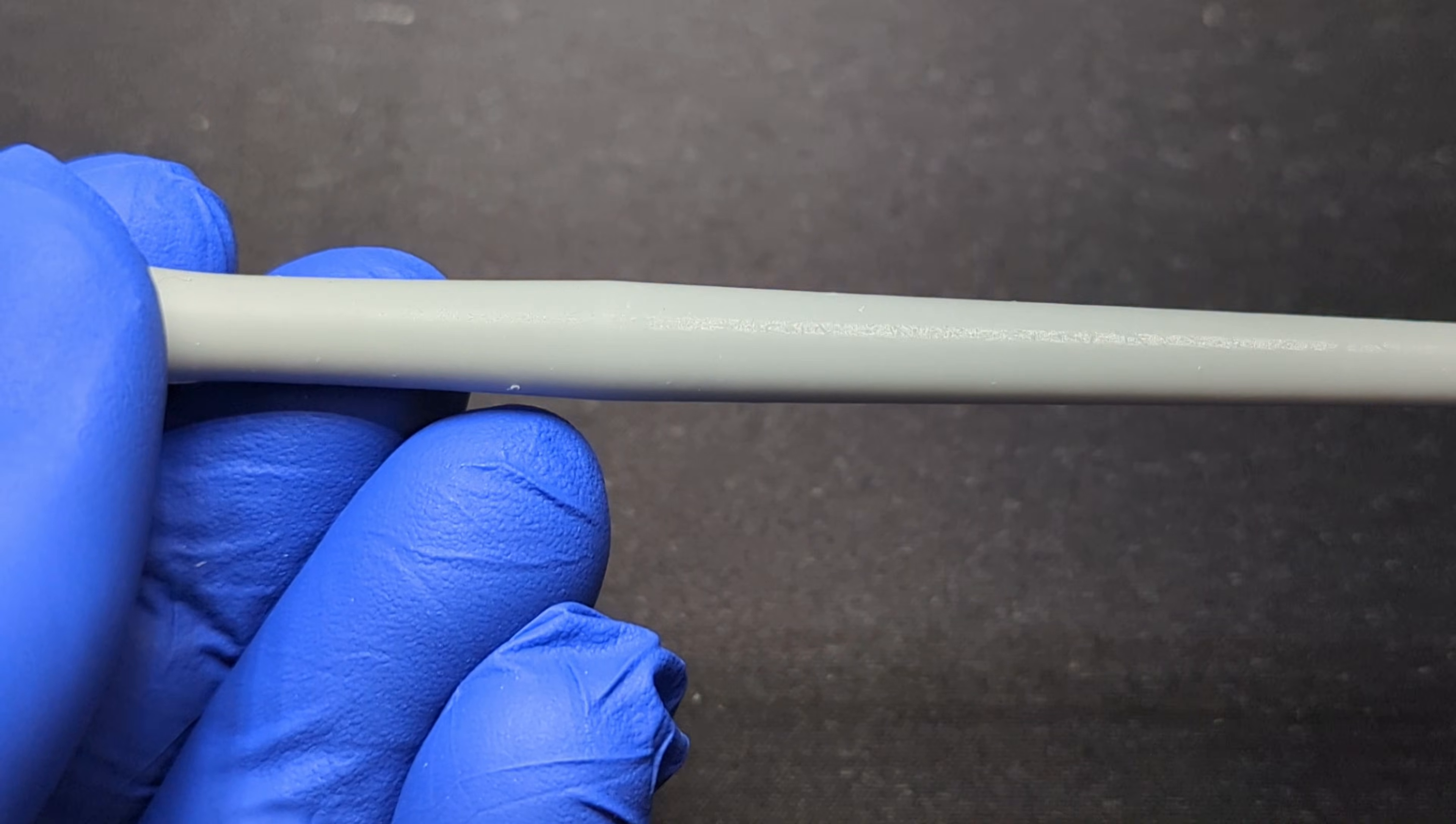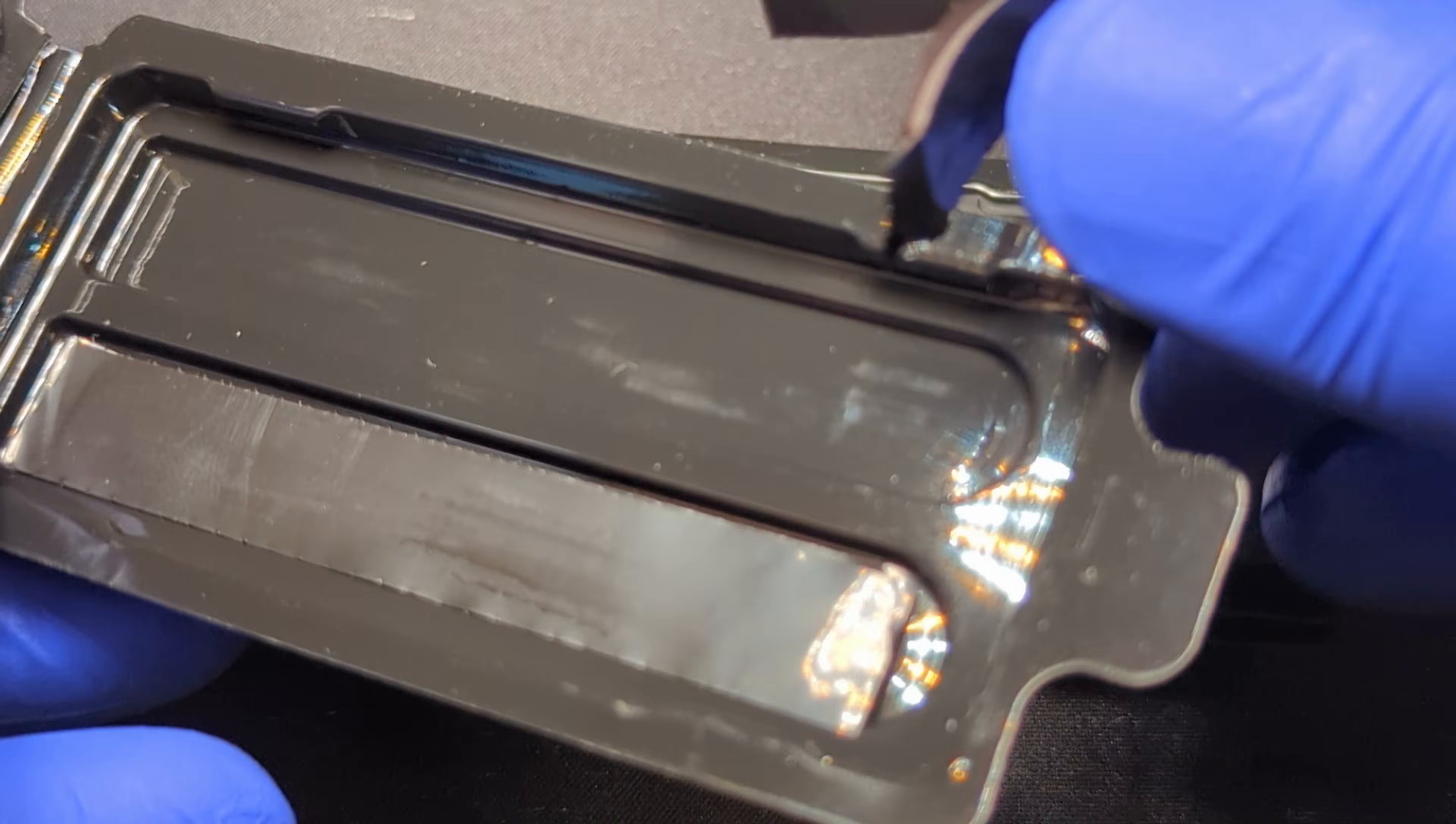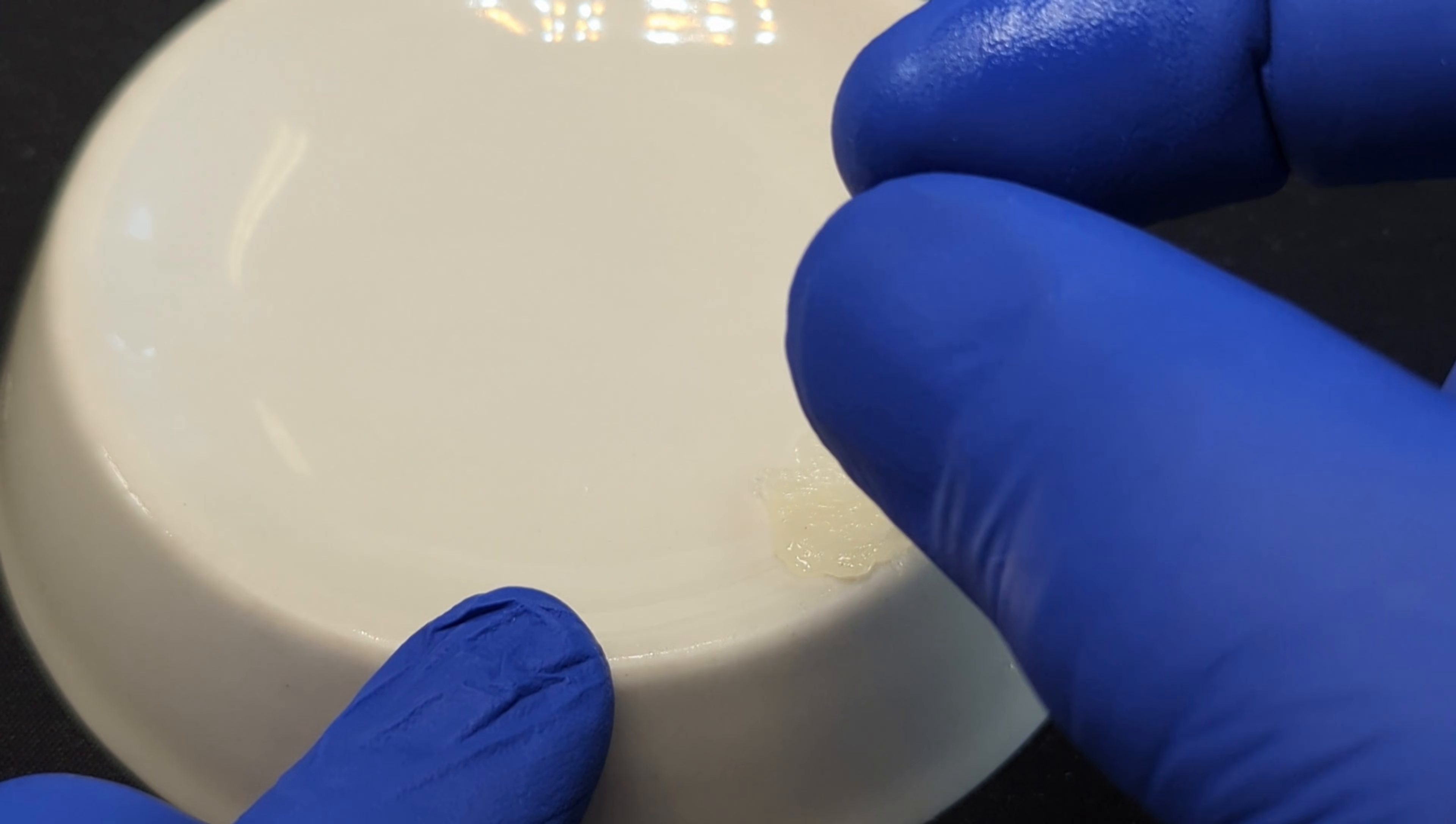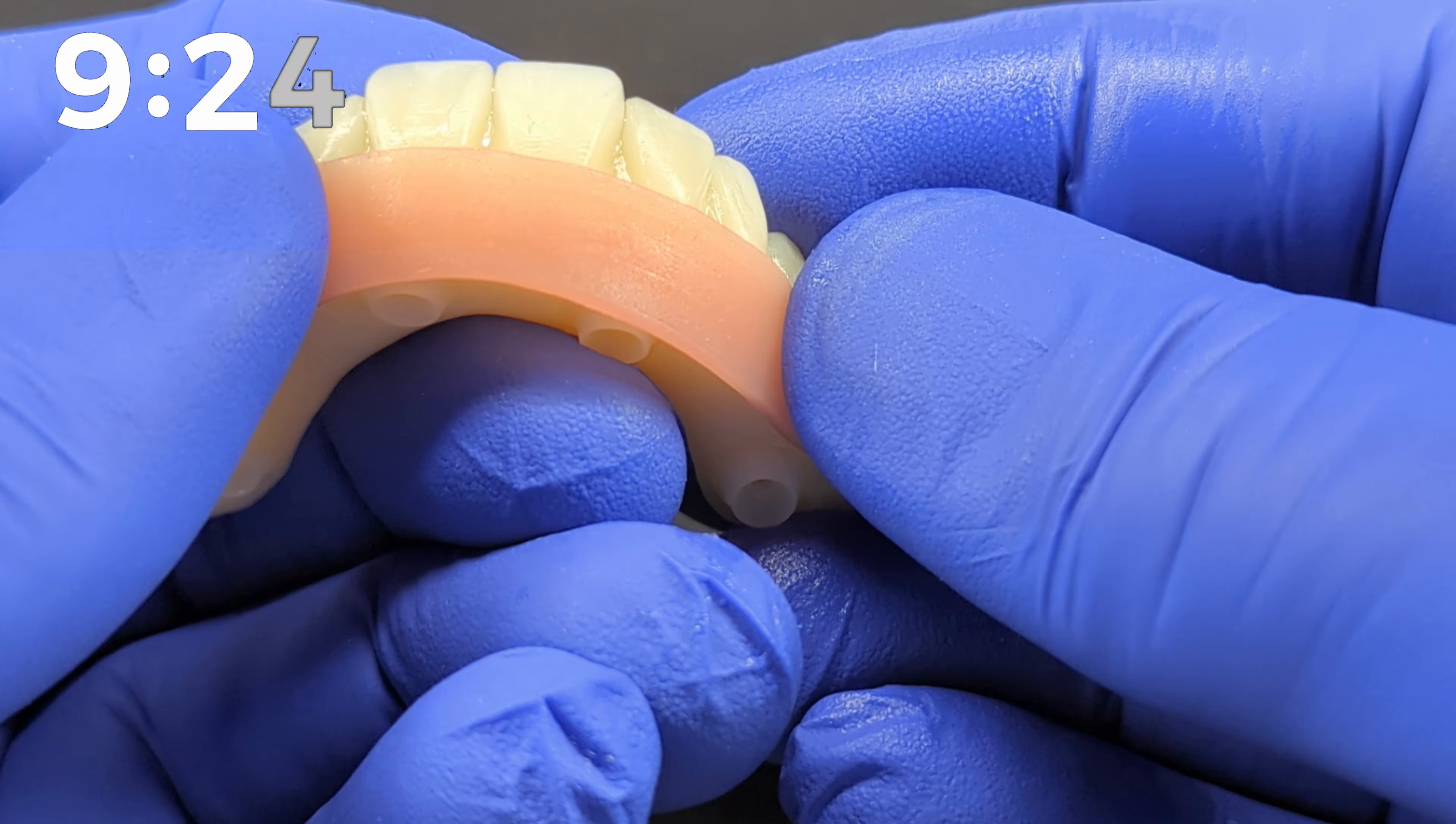Harvest Dental developed a special instrument for the use of EasyGum, and I will demonstrate later how to use it and the modifications I made for an even better result. If you are familiar with clay modeling instruments, you will notice that these seem inspired by them. EasyGum comes in perfectly portioned strips, each individually packaged in pairs. You can reuse any leftover material, and surprisingly, the surface of these EasyGum strips is not sticky. You can stretch them slightly before they tear, and my recommendation is to wear a latex glove and apply some Vaseline to make it even smoother in the handling. Applying EasyGum is straightforward, and I will demonstrate an efficient method. The application takes only 10 minutes, and you will see a timer in the upper left corner of the video.